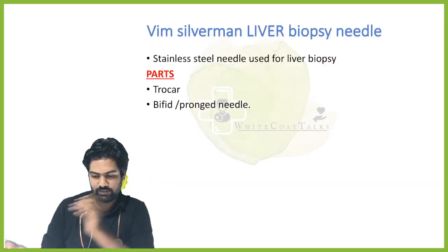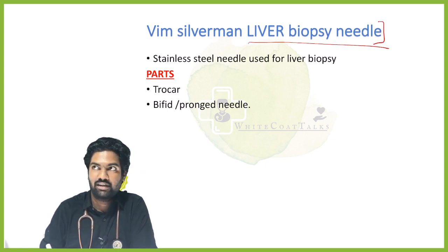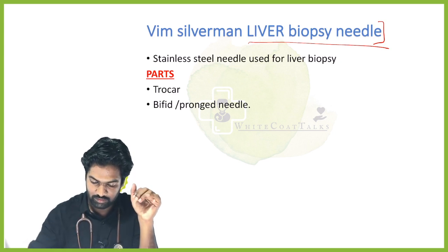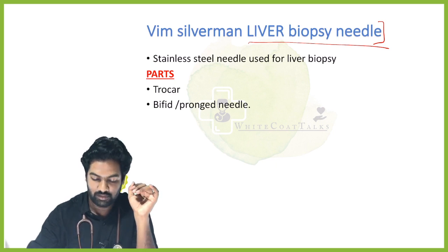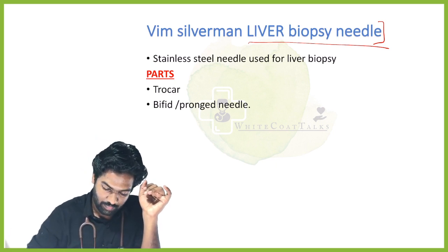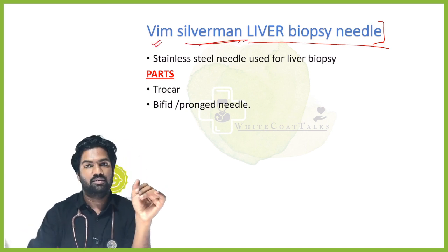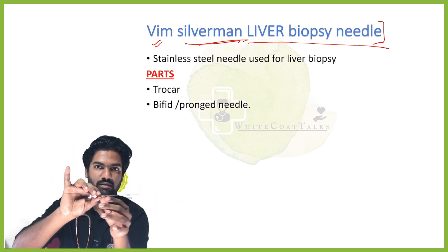Next needle, it will be asked many times. I want you to first identify this needle. How? This is a stainless steel needle used for liver biopsy. What is the name? Menghini or Vim-Silverman needle, or liver biopsy needle. It is a little long and slender. You can see this, long and slender.